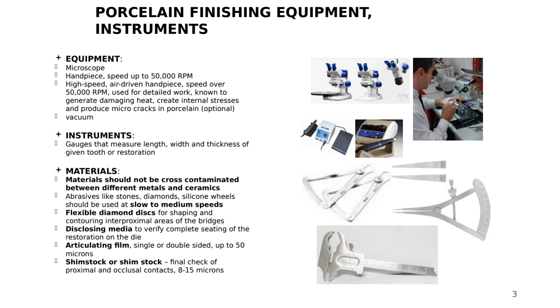And also, very important, we sometimes forget: I have a zirconia crown and I'm building up layering porcelain for that zirconia substructure, and I don't think about that substructure, the zirconia coping.